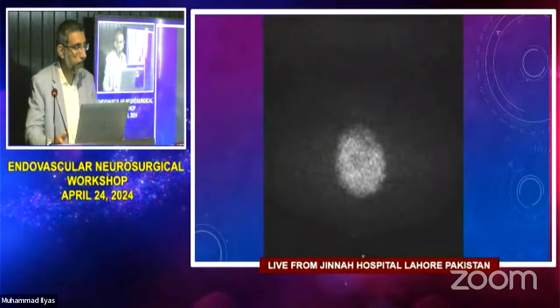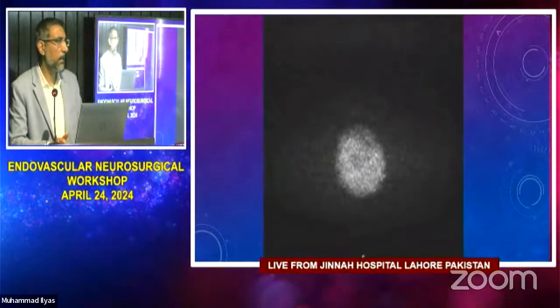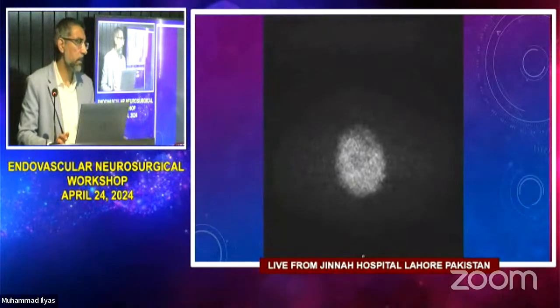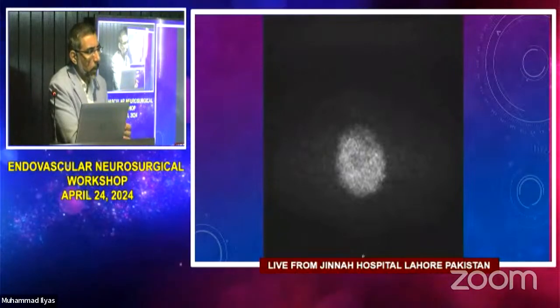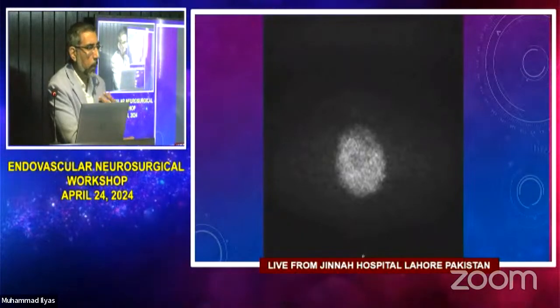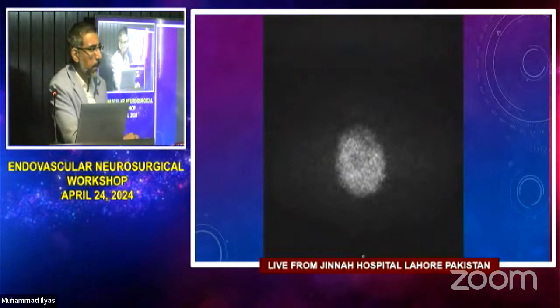And you heparinize the patient. Yeah, we just give 3,000 units of heparin. We don't flood them with heparin. We just give 3,000 so that the catheters don't clot. We heparinize the patient even for our angiograms and whatnot. I just don't want any clot forming on the catheter and then showering. So I'll just give them 3,000 heparin typically, not much.